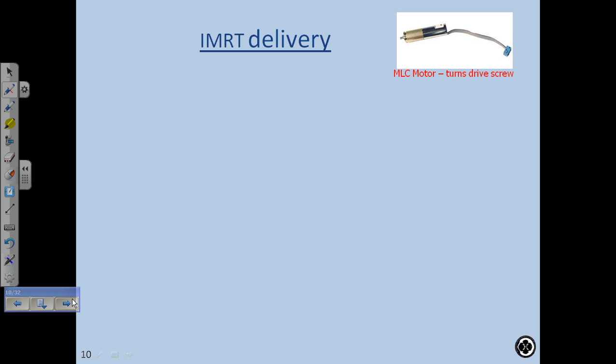But I think there was a confusion there, because there's a distinction made between the hand and the alpha cradle, or the alpha cradle just wasn't factored into it. I'm pretty sure they didn't contour the cradle. It sounds like it was one of the first times that an alpha cradle had been used for that. But it's a good idea to treat a hand evenly, because it'll make the distribution even throughout the inside of the hand.